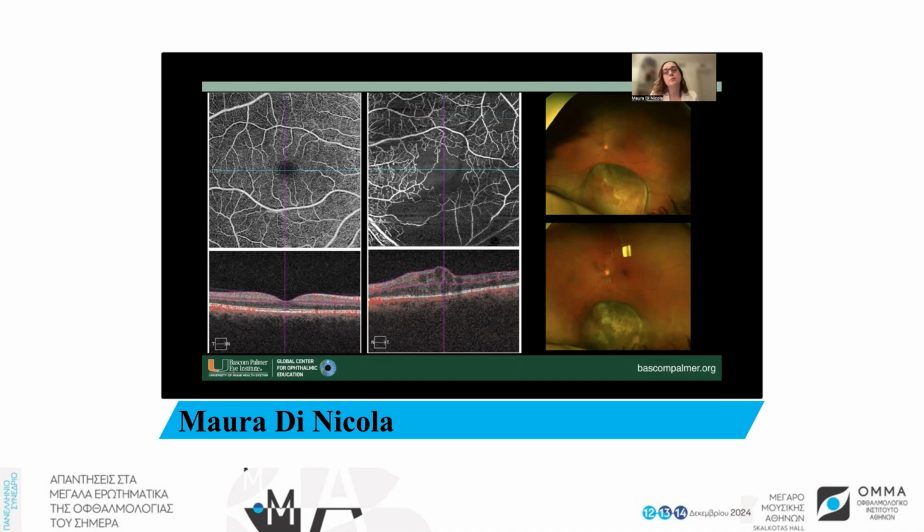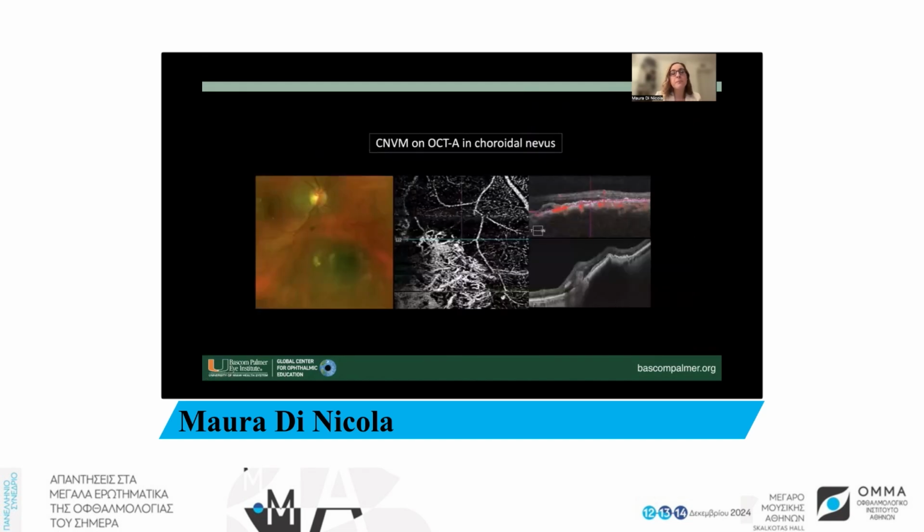This is particularly important because it can give us an indication as to whether or not it is appropriate to continue treating this patient with intravitreal injections of anti-VEGF, which we often do for a radiation-related complication such as radiation maculopathy. So you can see that there's still intraretinal fluid here. However, it might not be indicated to continue treatment for this patient because even if we get rid of this intraretinal fluid, the macula is very ischemic, therefore his visual potential might be very limited.